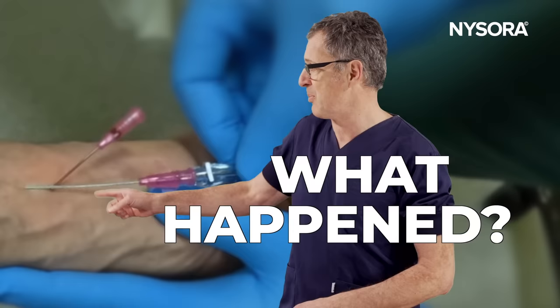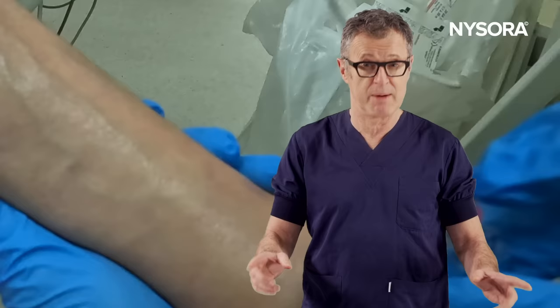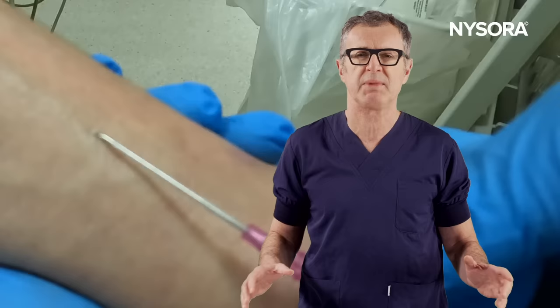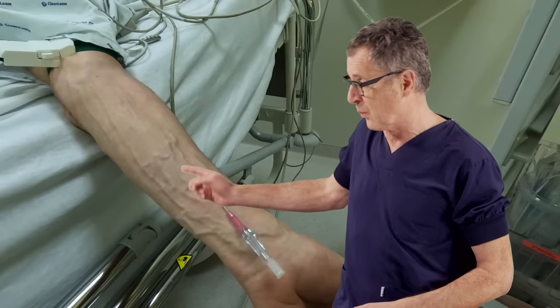Greetings. Let's watch this video and try to answer the question: what happened here? The question is, why did this attempt at IV cannulation fail? We will demonstrate the most common mistakes during IV cannulation that can make attempts at IV paradoxically difficult, even in patients with well-visible veins. The video will also feature an augmented reality animation that will help you see a three-dimensional explanation of the problem.